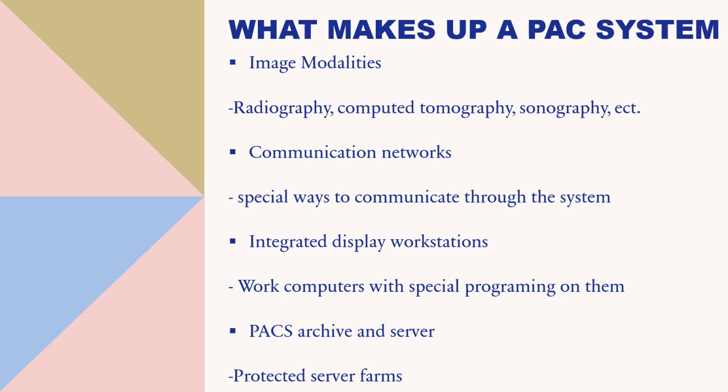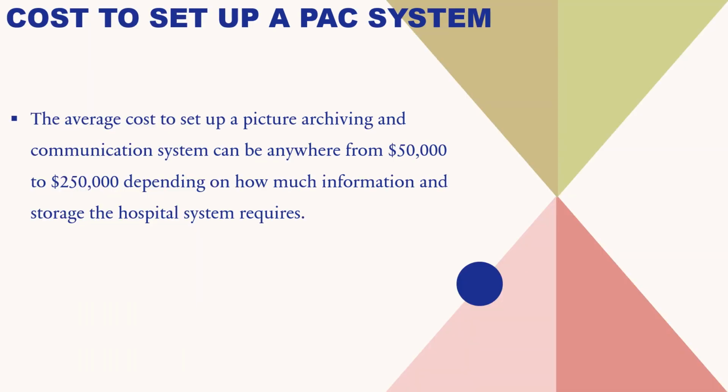Work computers with special programming on them. That ties into the PAC's archive and server. So that is the protected server farms we were talking about with the local and the wide storage. Those are a part of the hardware as well as the workstations, and that's how the software and the hardware tie together to make this safe and make sure it doesn't violate HIPAA or anything like that for the patient's medical information.